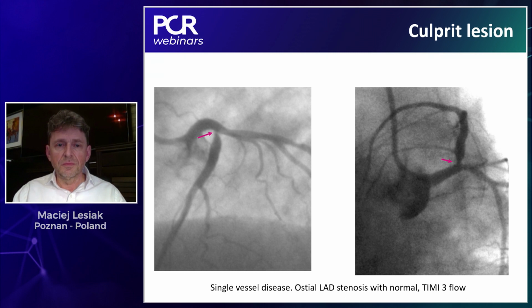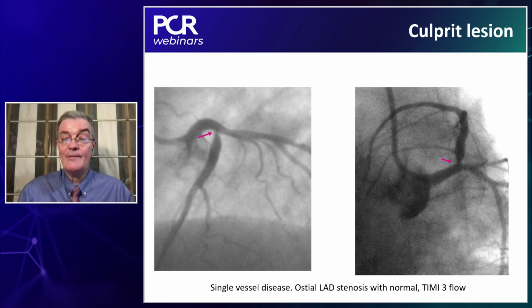Yeah, this is a great example. We see it frequently in the cath lab, and there is always the question: should we try to be very precise, or do crossover stenting, then POT and kiss? That's, I think, an unanswered question so far. We have already a question from Amar Imran. I ask about the Szabo technique. Is it still used? And what is the disadvantage of this technique?